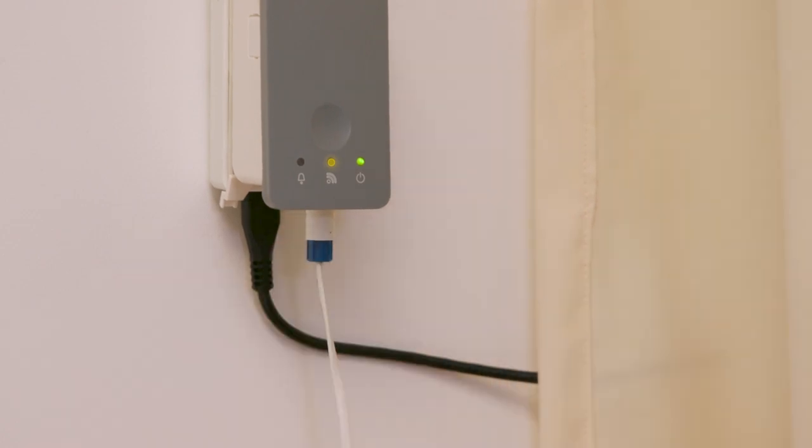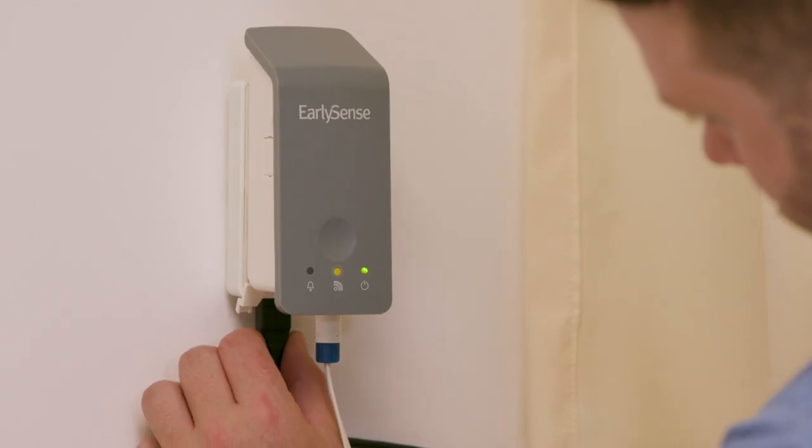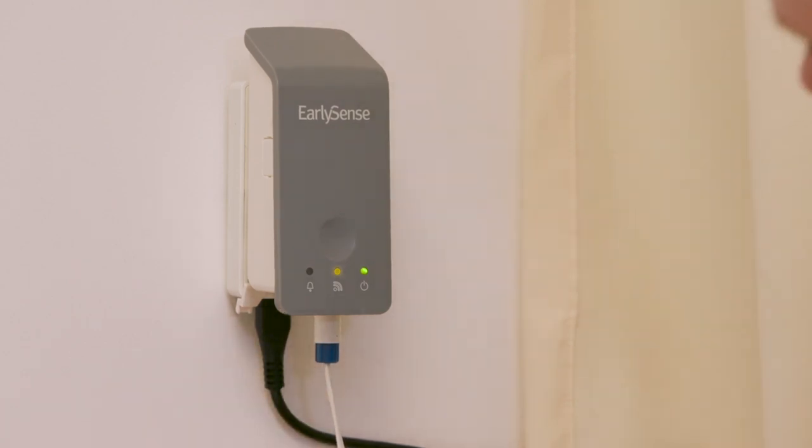Further, ensure the InSight device is connected to the cradle. Also, check that the power cord is firmly connected to the cradle and plugged into the power outlet.